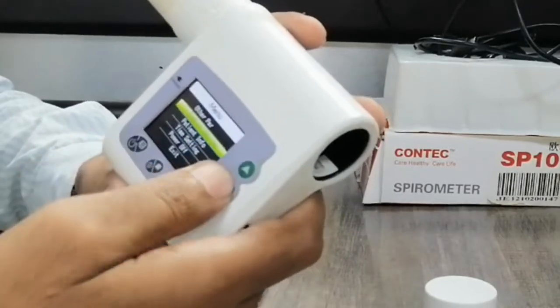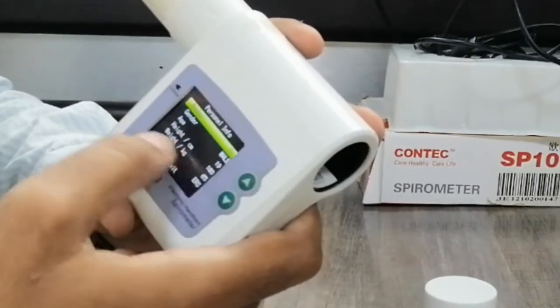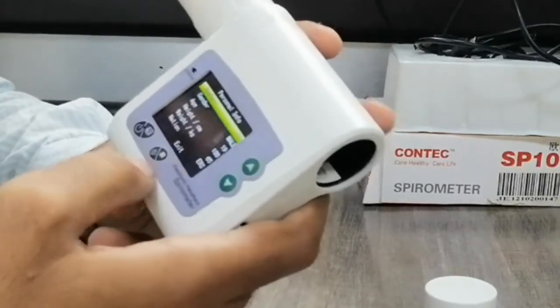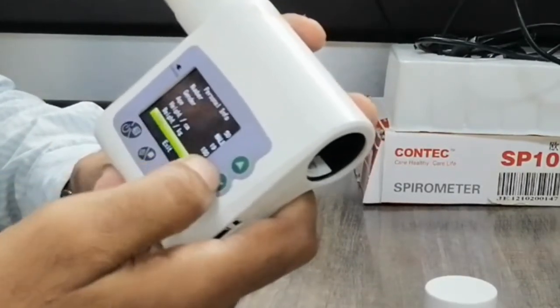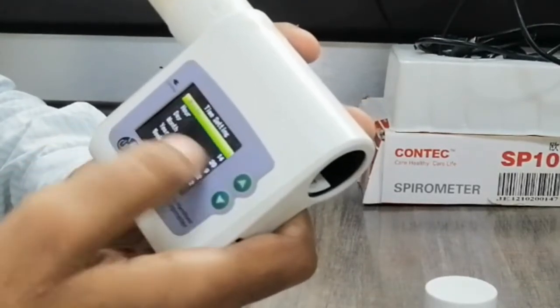Under patient information, you can add the patient number, patient gender, age, and other details so you can get an exact result from this machine. Similarly, under time settings, you can set the time — minutes, hours, year, and week as well.